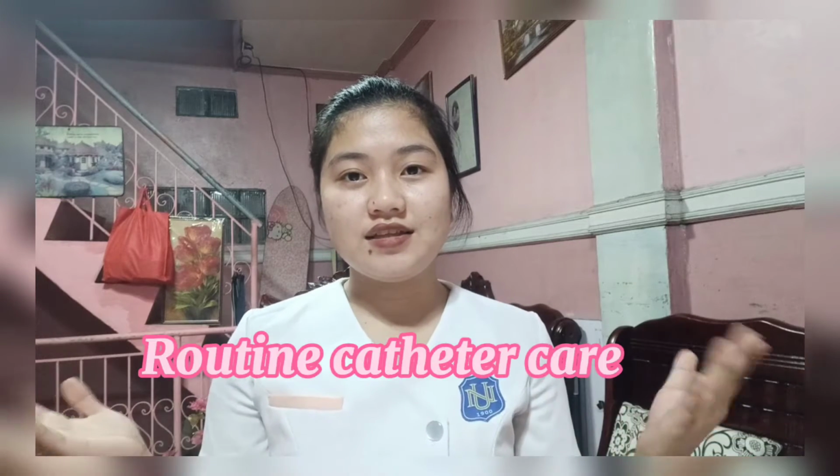For today's return demonstration, I will be performing urine catheter care. What is routine catheter care? It involves an indwelling catheter that is used to provide continuous drainage of urine from our bladder. The catheter itself, which is attached to a drainage bag, may be used for episodic or long-term urinary drainage.